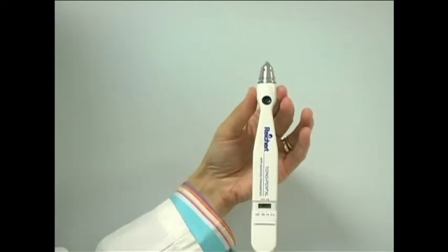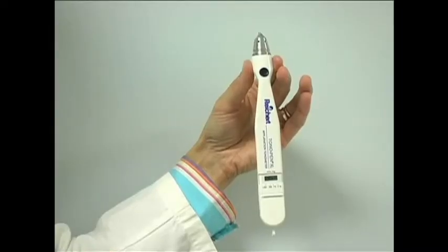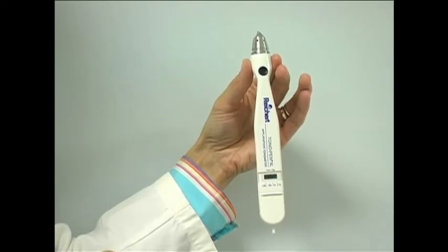Turn and hold the Tonopen up until it beeps and you see good on the LCD screen. Now you're ready to go. If you receive other output, calibration should be repeated. Low batteries or a need for maintenance are often the reasons for difficulty in calibration.